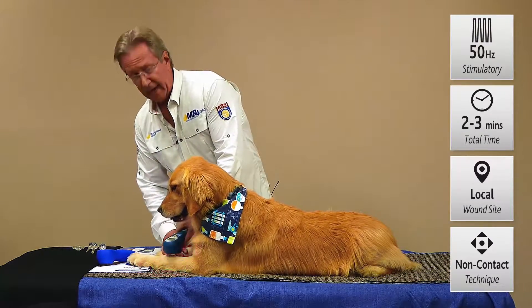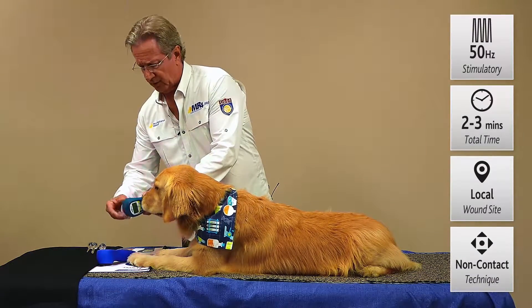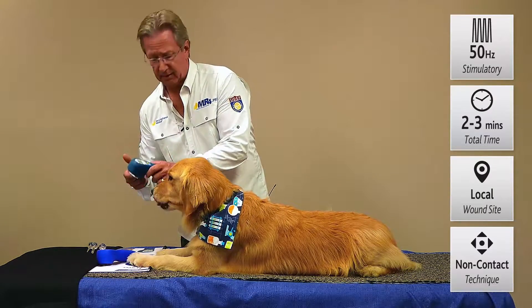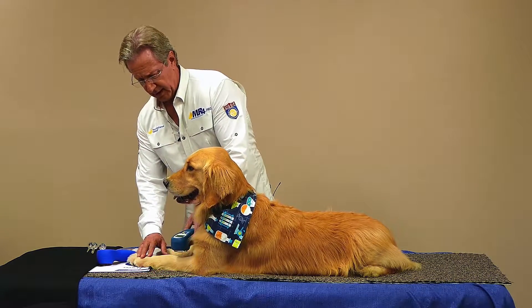You're hovering over at about a half an inch from the surface. You can also use the dome probe, which is very nice if it's a nasty infected wound — that gives you the ability to come back afterwards, remove the dome probe and disinfect it. But you're still just hovering over the surface at about a half an inch above, and just slowly scanning.